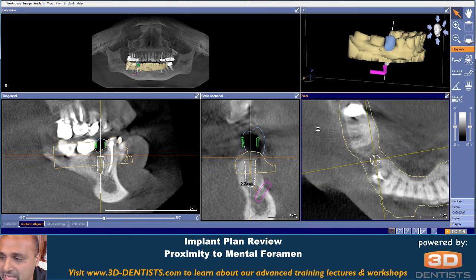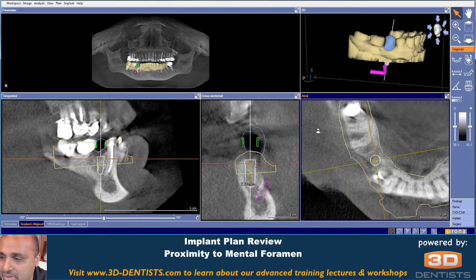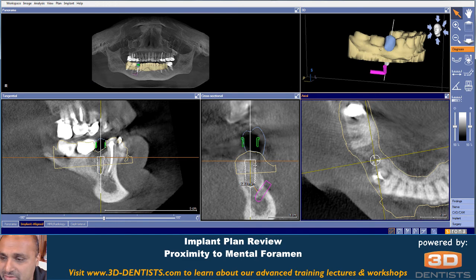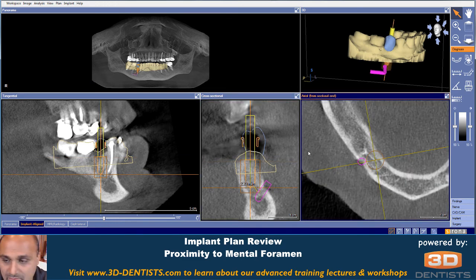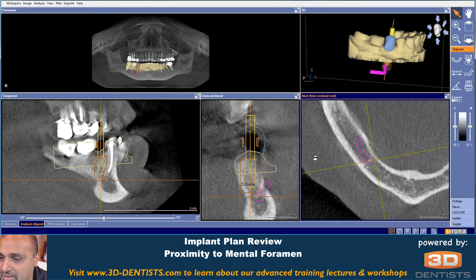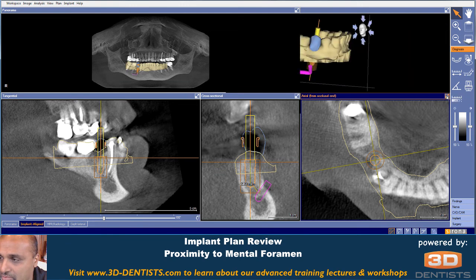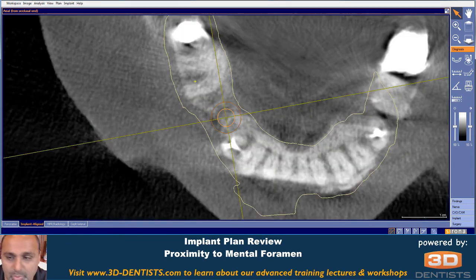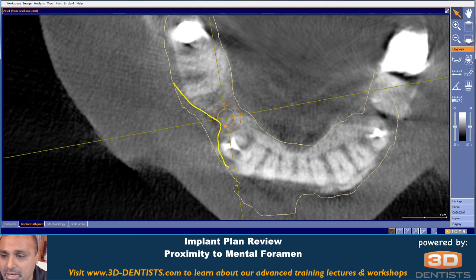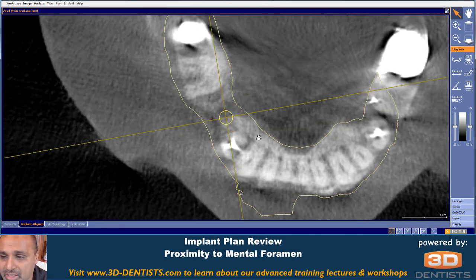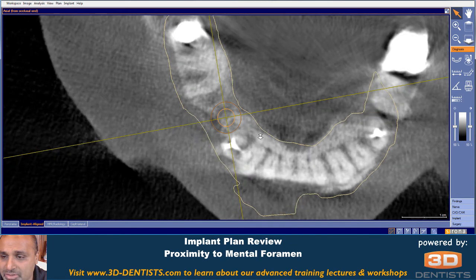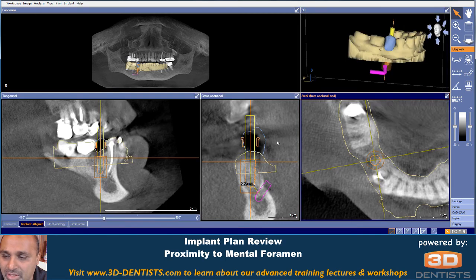As we take a look in the axial view, we can actually start to see that our implant right here — our bone does seem to come in quite a bit there, and it does seem that our implant may actually be outside of the bone right in this area, necessitating some potential grafting there within tissue.